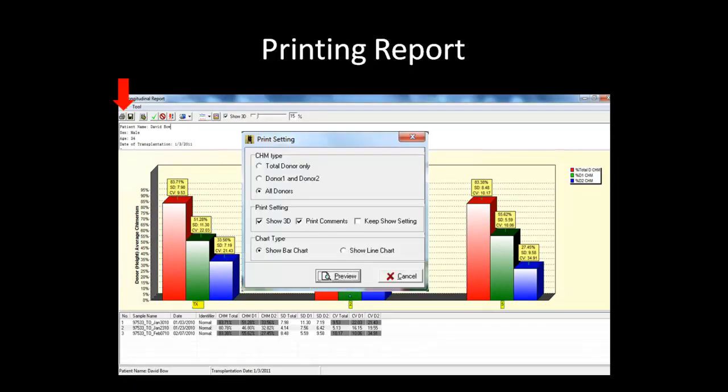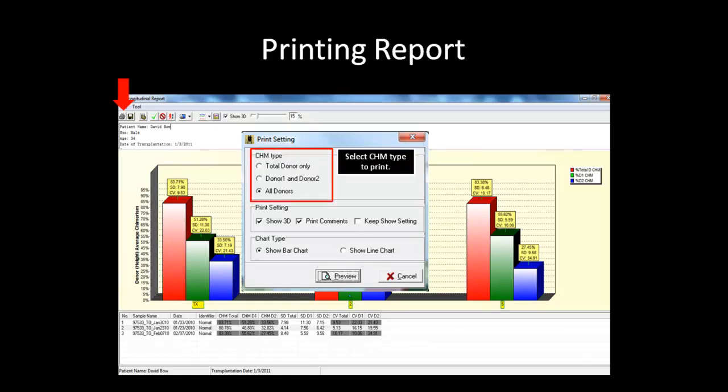By clicking on the print icon in the toolbar, the print dialog box will appear. For a double donor report, the option to print total donor only, D1 and D2, or all is available. In a single donor report, these options are not applicable. In the print settings, you can choose to print the graph in 3D along with comments. The Keep Show Setting option will print the graph as it appears in the main longitudinal window.